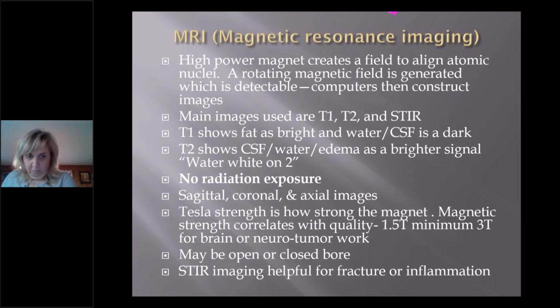The other thing is that anything inflammatory, swelling, bleeding, things like that are generally going to have a white or whitish appearance because it's more liquidy on T2 weighted imaging. And on T1, it's going to be darker. So those are some of the differences, and I'll show you guys pictures of that in a minute.